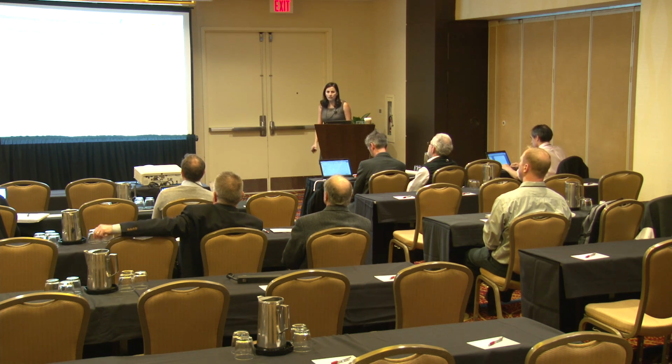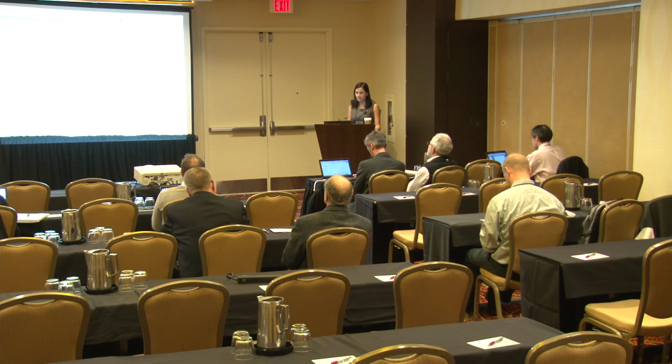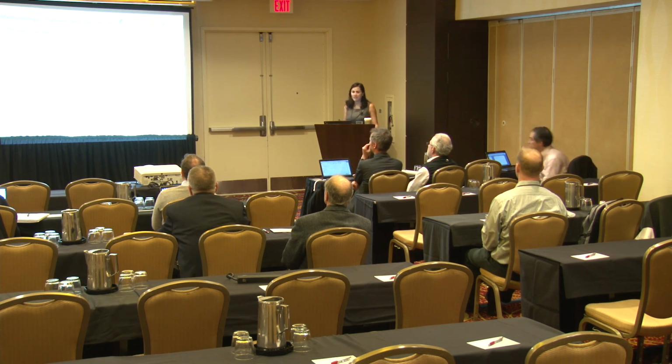So for this work and in the interactive interface, we have used data from 11 phase 2 studies, 1951 subjects with tuberculosis, 16,725 TTP observations.